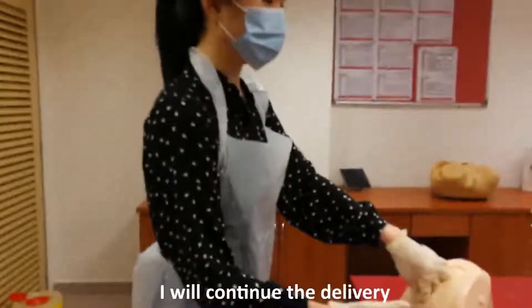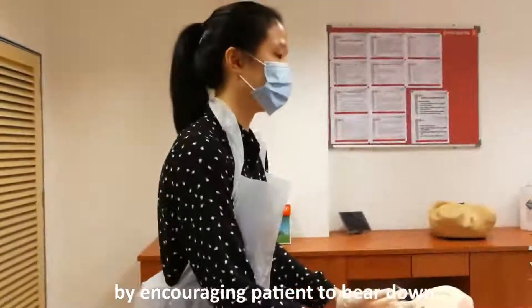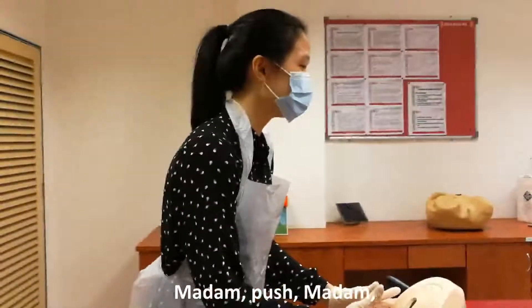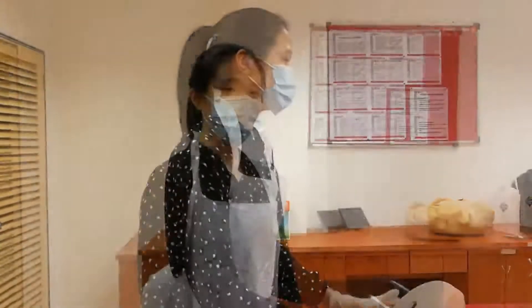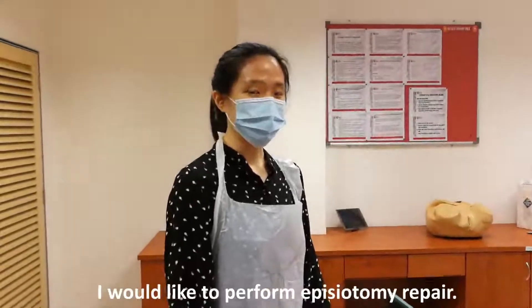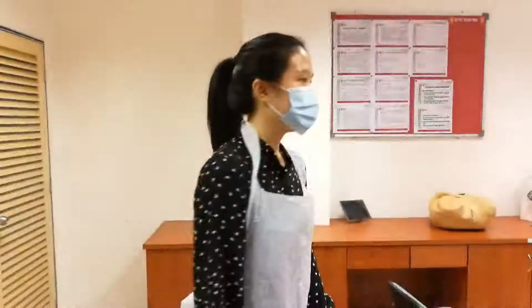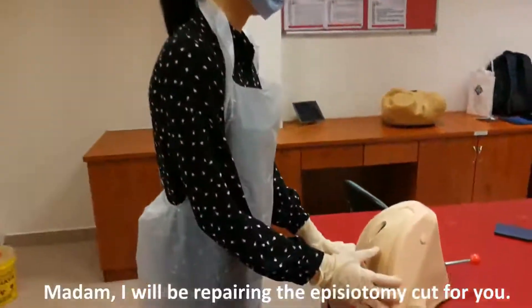I will continue the delivery by encouraging the patient to bear down. Madam, push! Very good! Push! After the delivery of baby and placenta, I would like to perform episiotomy repair. Madam, I will be repairing the episiotomy cut for you.